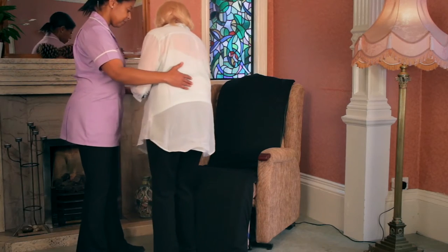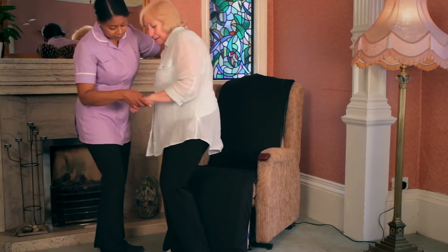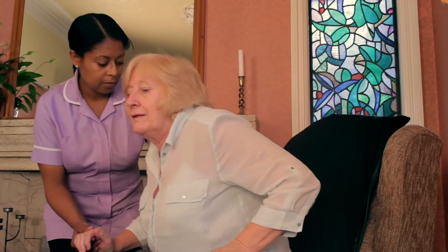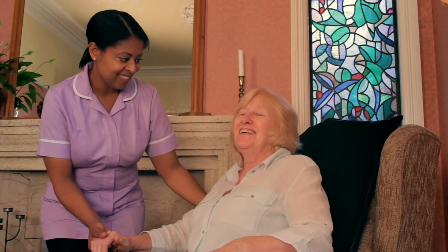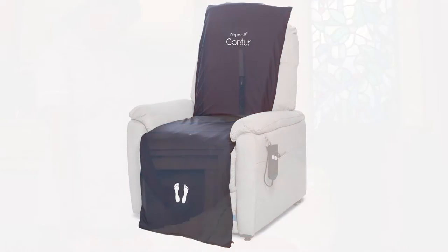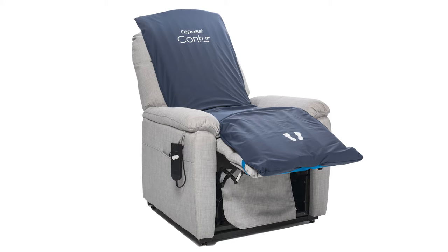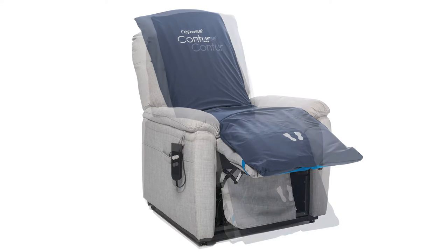Repose Contur is part of the Seating Solutions range, providing an effective method of pressure relief and redistribution, reducing the pressure exerted at the interface between the patient and the supporting surface. Repose Contur is a pressure redistribution cushion overlay for a riser recliner chair, utilising the Repose Reactive Air Pressure Redistribution and Reduction Support Surface.